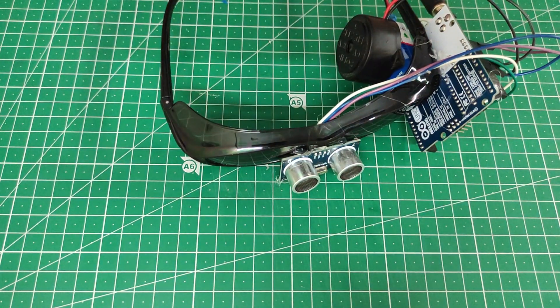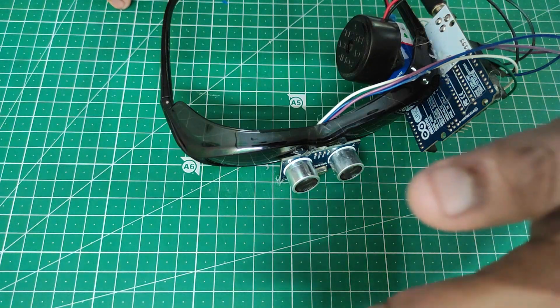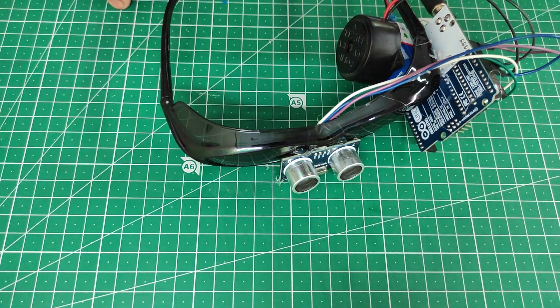Now we'll see the working of the smart blind glass. If any person or obstacle is less than one meter away, it gives a beep sound or alarm sound. I will place a hand in front as an obstacle — it gives a sound, you are able to hear it.